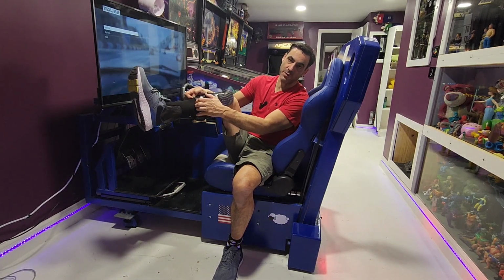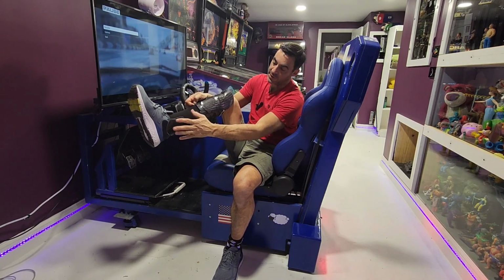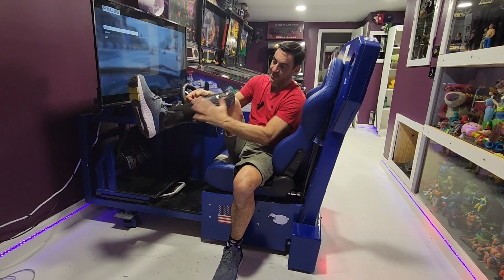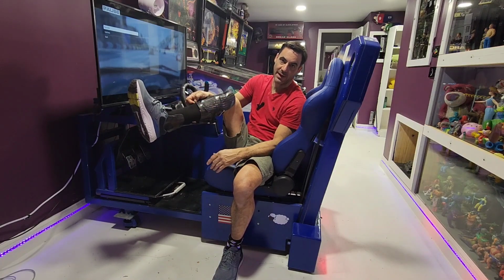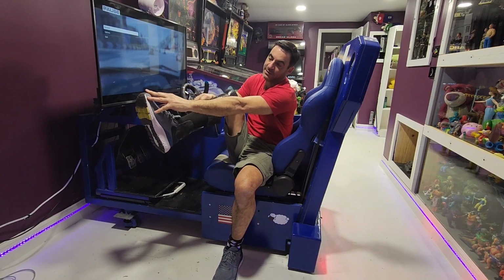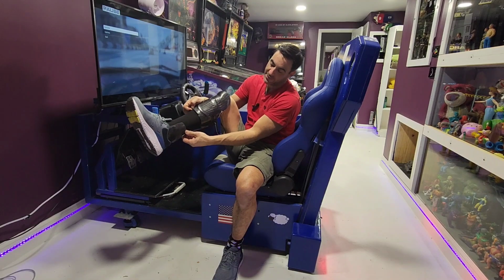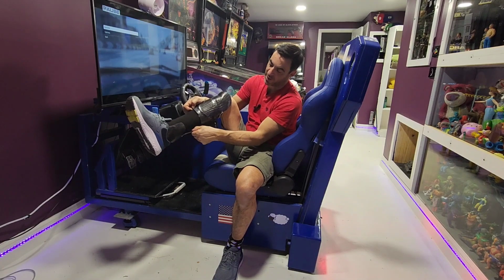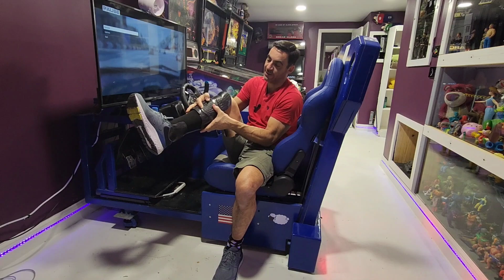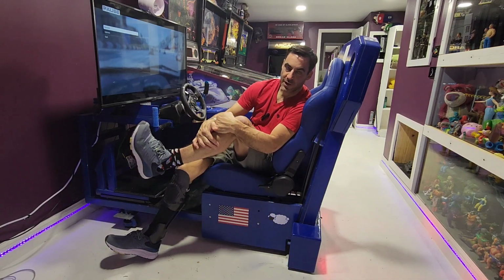This was custom made for me by the Hanger Clinic in Chattanooga, and this is all carbon fiber. They take a mold of your leg, and they basically make this completely custom fit. So the whole bottom bit takes all of the sole of my foot and comes up around the back. And then there's this bar, which is actually a spring. And then there's this clamp around your leg here. So this ultimately means that my foot can't do that.